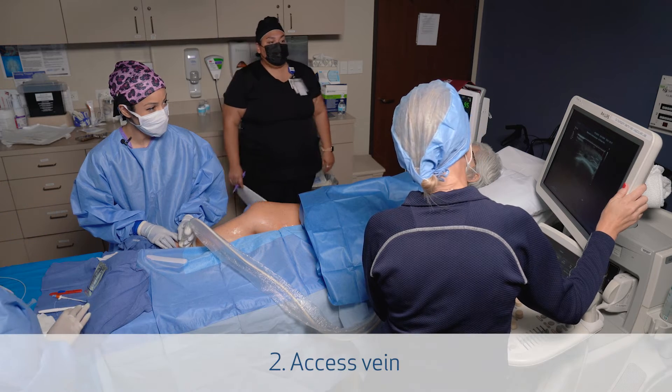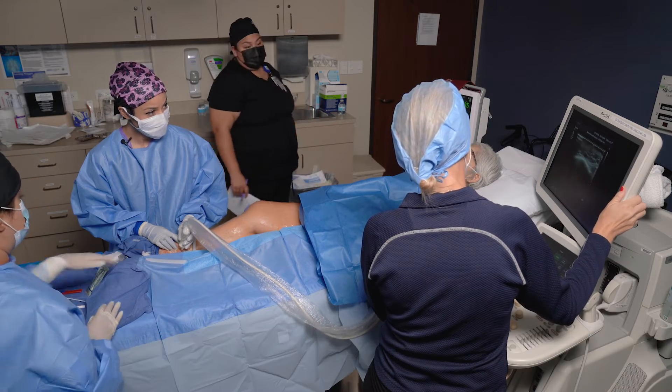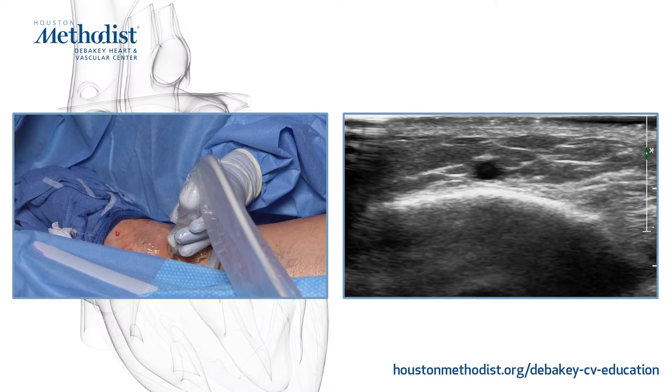One of the benefits of VenaSeal, particularly for my venous ulcer patients, is that you can treat the entire vein below the knee without having to worry about thermal saphenous nerve injury.